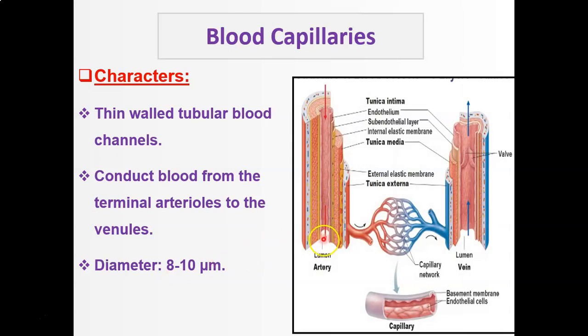This is the artery carrying the blood, oxygenated blood.